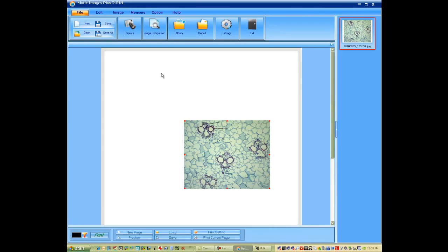Activate the text tool. This will open up a text box. And the text box, Zea Mays.